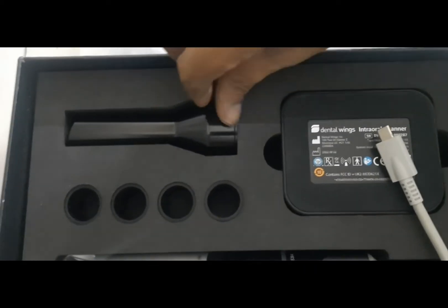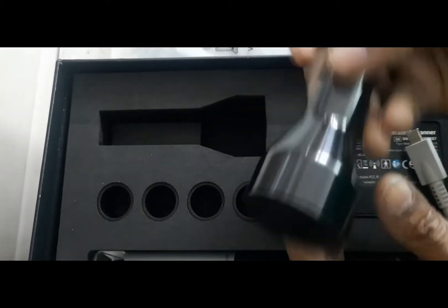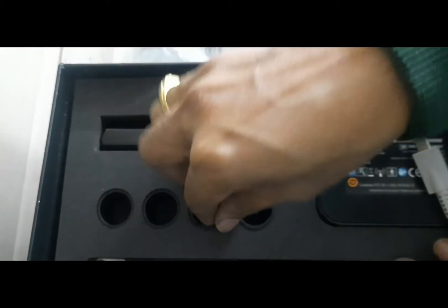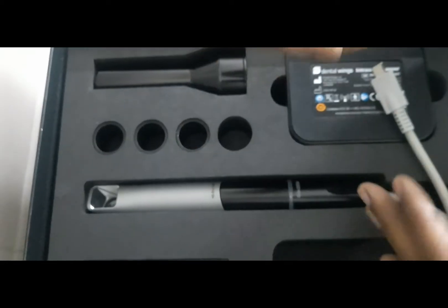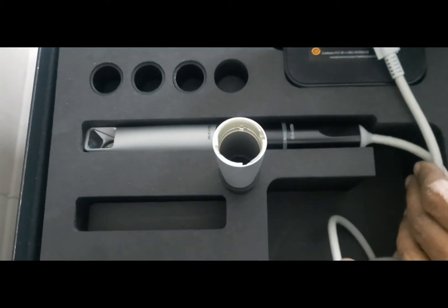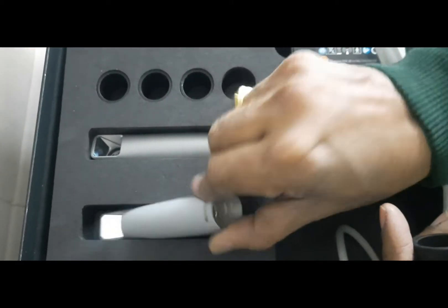This is the calibration tool which you need to calibrate the scanner. This is what the calibration tool looks like, and apart from these there are sleeves to protect the scanner — you just place them like this so it will not roll down or damage the scanner.